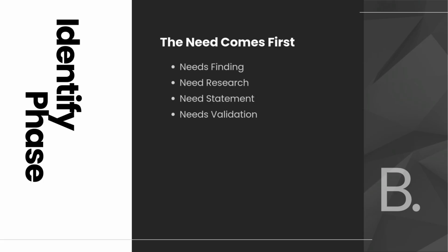The identify phase is where biodesign thinking truly begins. Its purpose is to understand and define the right problem before any solution is considered. Instead of starting with technology or form, biodesign emphasizes a deep investigation of unmet clinical needs. In this phase, designers observe patients, clinicians, and care environments to uncover pain points, risks, and inefficiencies in current practice. These observations are supported by research into the disease context and existing solutions. The outcome is a prioritized and measurable needs statement, carefully written without embedding a solution, and validated with real evidence.